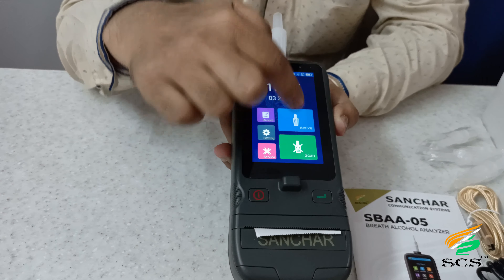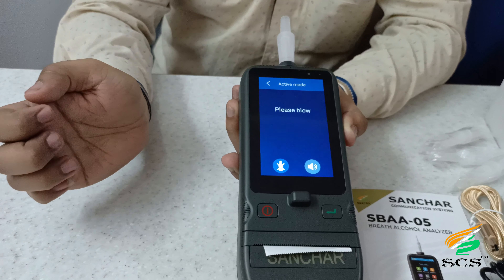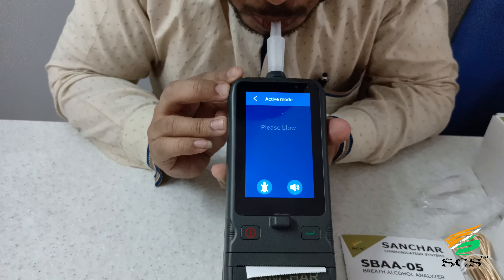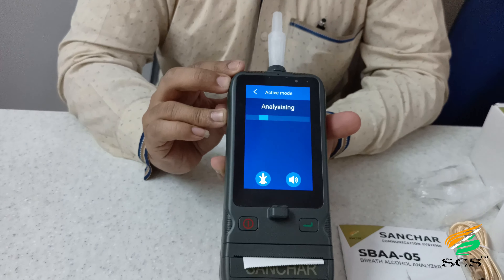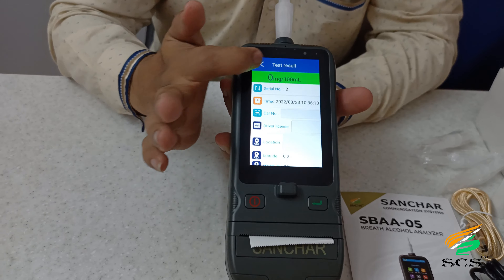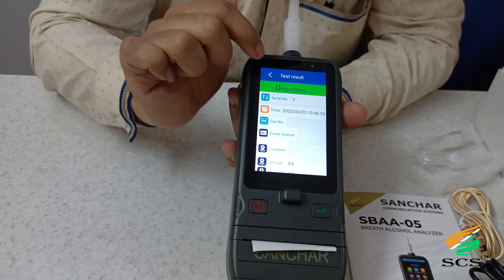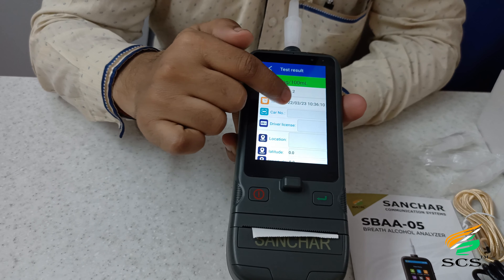There are two types of testing: active and scan. For the active test, you need to put the mouthpiece on the device. When you click on active, a 'please blow' prompt shows on the screen. You have to blow air through the mouthpiece. The device analyzes the test result and shows the reading — in this example, it is showing 0 mg per 100 milliliters, which means the result is negative.